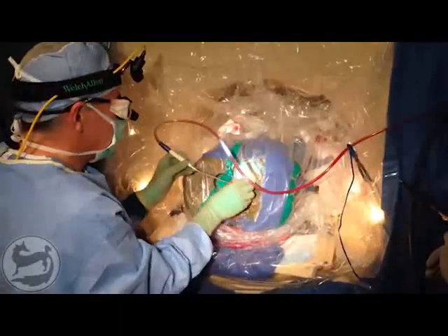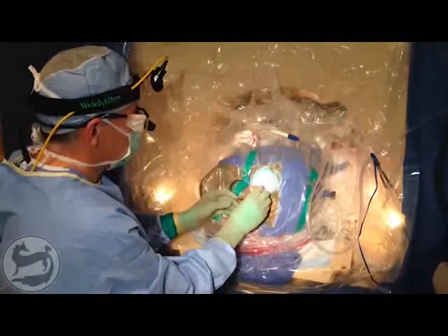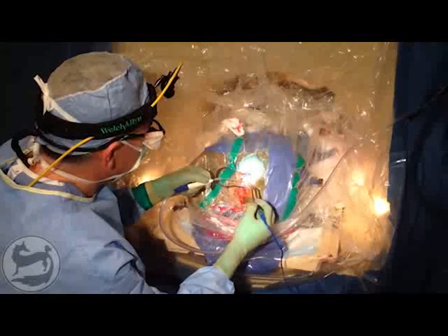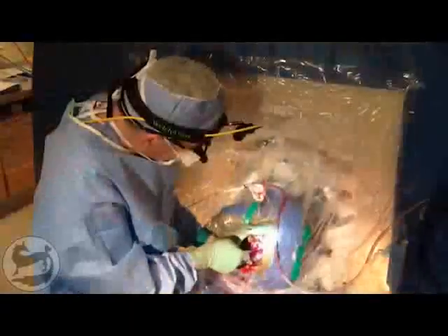The edges of the borehole are bone waxed. The size of the borehole is checked using a centering tool. The dura is coagulated and opened, and the smart frame base is secured into the outer table of the skull.